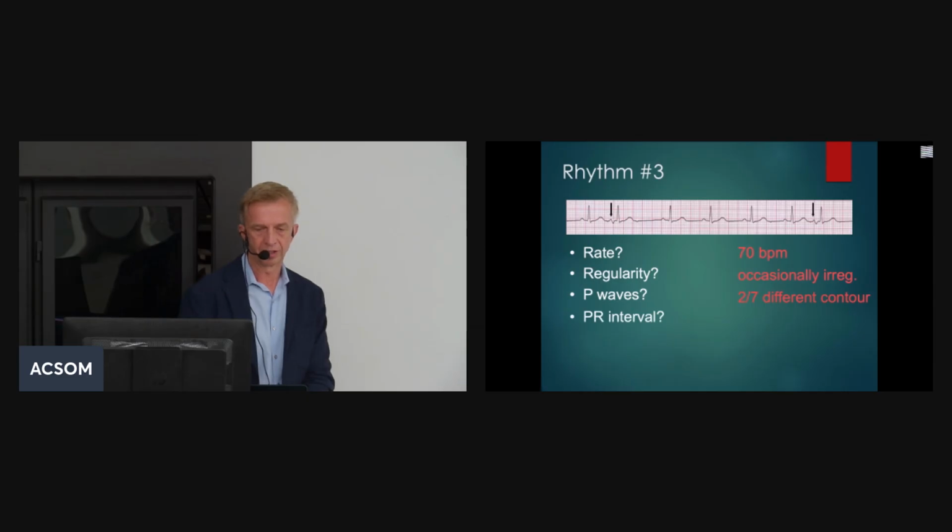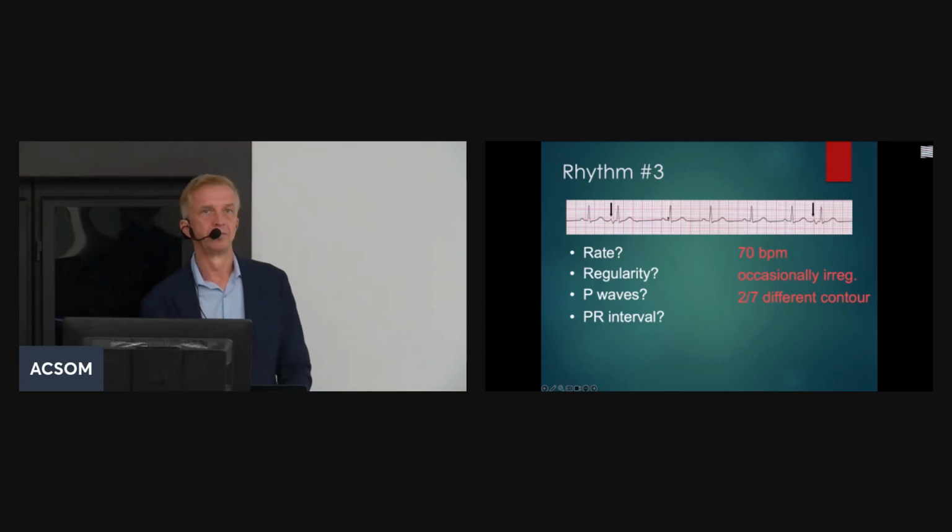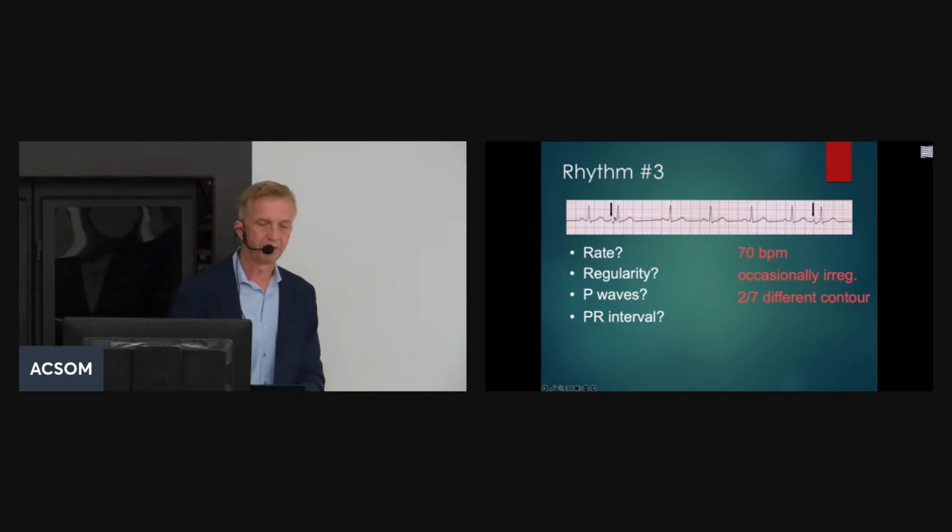There are two PACs here on this rhythm strip. There is also a little pause after the premature atrial contraction. There is a compensatory pause. Why is it? Normally, after the premature atrial contraction, there should be a normal sinus beat somewhere here. Why is there a pause here?